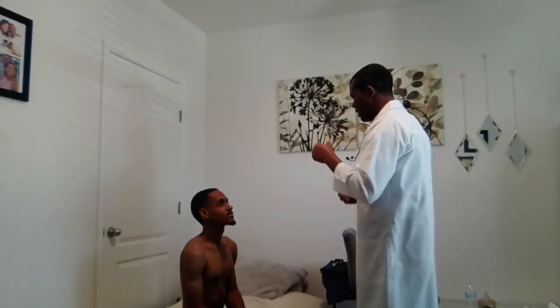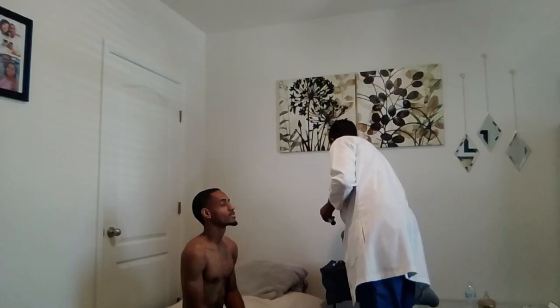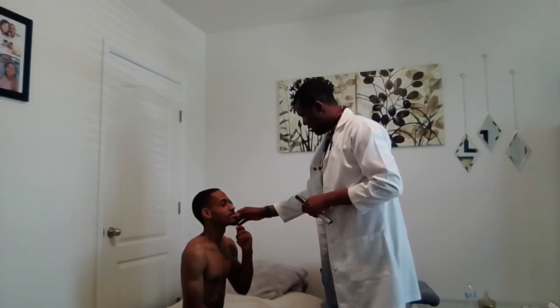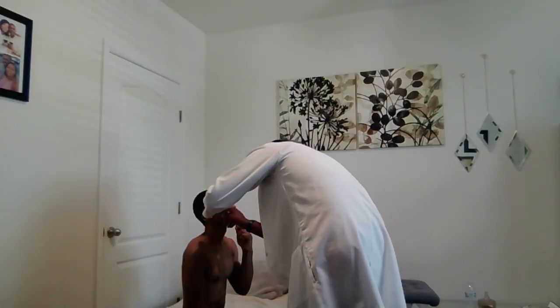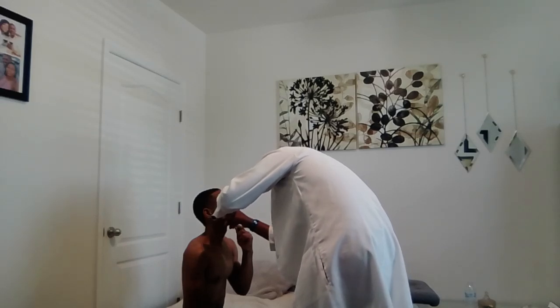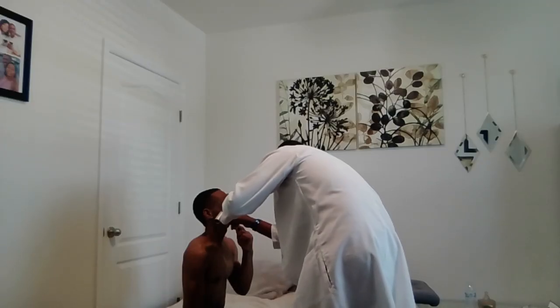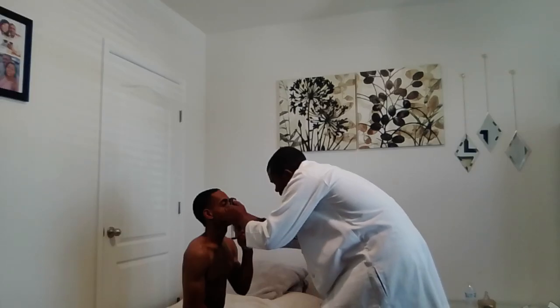Frank, now I'm going to assess your eyes. I'm going to shine a light in your eyes, but for me to do that, I'm going to ask you to cover your eyes with this one for me, okay? Cover this one, okay? All right, I'm looking at the left eye. I can see the red reflex. Optic disc can be seen.